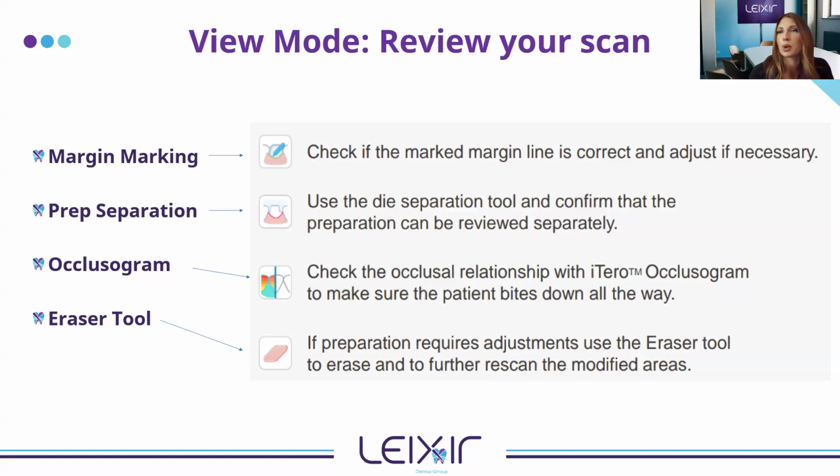What I will say is if you want to mark your own margins, you certainly can. Please notate it in your notes section so that the lab knows to go off your marked margins. And I will talk about this a little bit more and show you so it makes a little more sense when we do our live demo.